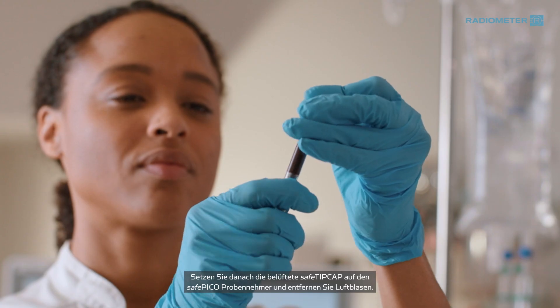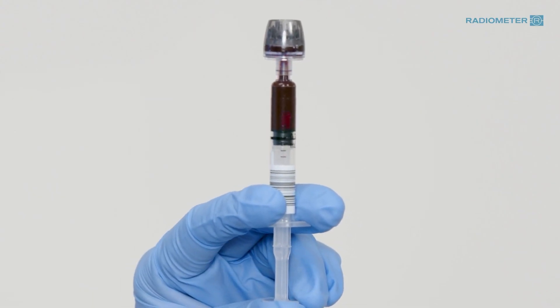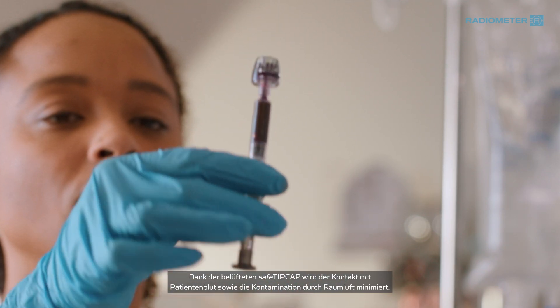After taking the sample, place the Vented Safe Tip Cap on the SafePico syringe and expel air bubbles. The Vented Safe Tip Cap helps minimize healthcare professionals' contact with patient blood, as well as room air contamination.